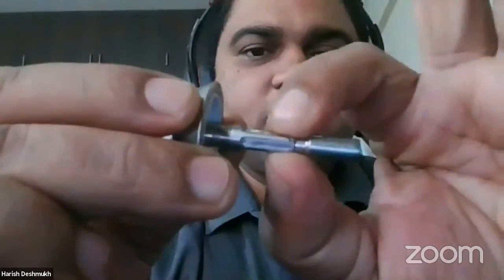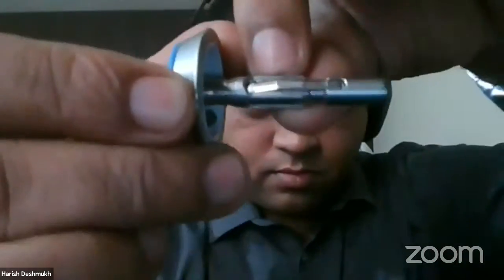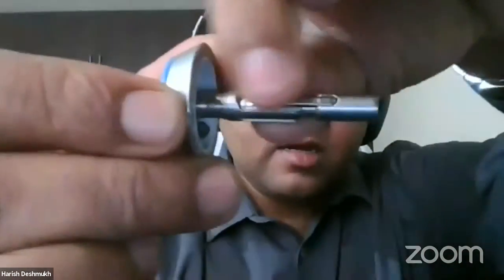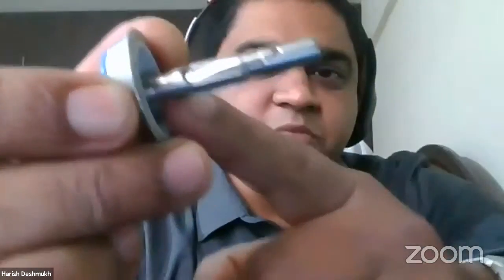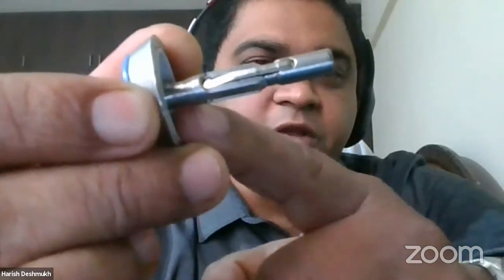So this goes into the proximal end of the lumen when you have done the resection basically. You will put the tissue over it and do a purse string and hold it tightly. While doing the purse string, you have to be careful that there is a notch here. You can see this notch. This notch should not get pierced or submerged in the tissue. So the purse string should be below this.